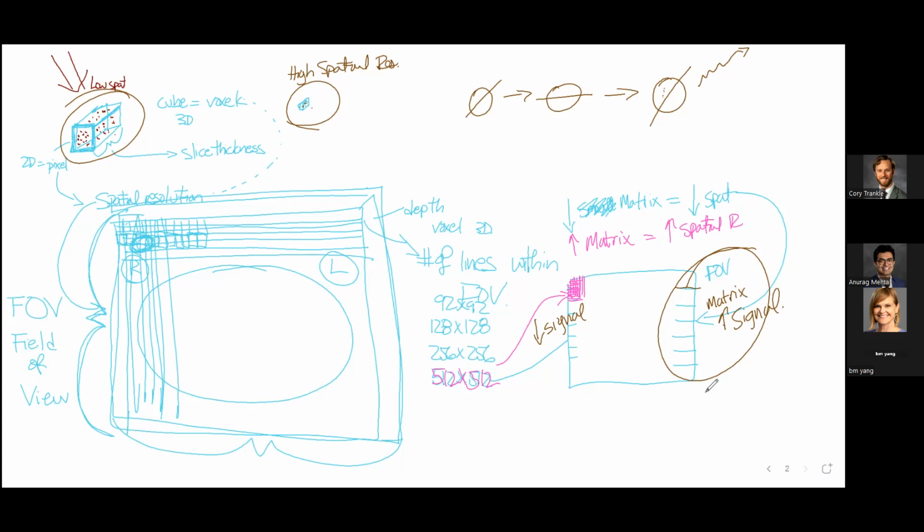If you set the size of this picture to here, the problem that you get is this part of the person wraps into the image. We're going to talk about that later. You're going to see examples of that. But you have to set the size of the picture. You've got to be thinking that this picture is made up of these voxels, and you're imaging those protons and how they behave in that magnetic field with that FM radio wave thing.